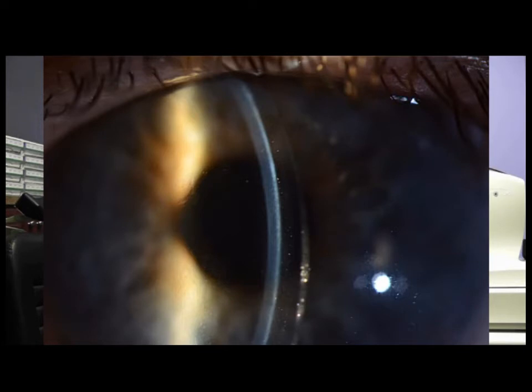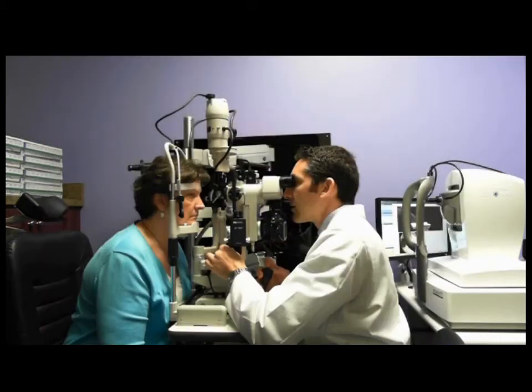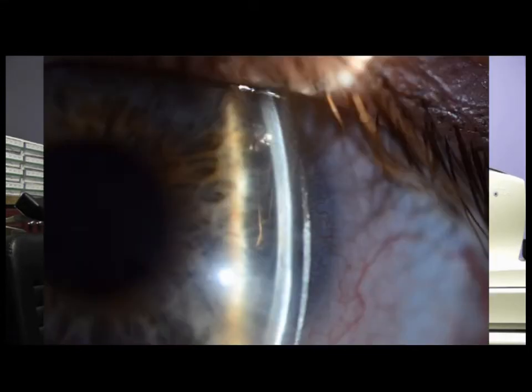So here you can see, and let me know if you don't see my arrow. But here we have that nice post-lens tear reservoir. This is the anterior surface of the cornea, and right there is the posterior surface of the lens. So this is all nice post-lens tear reservoir here. It's giving us an idea of where we're vaulting the cornea. Now as we get off to the periphery, the vault declines quite a bit. And let's look nasally as well.